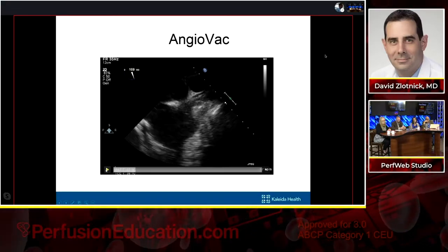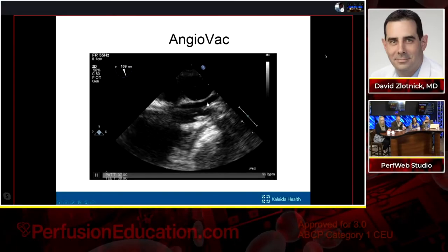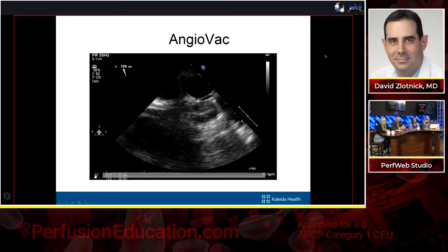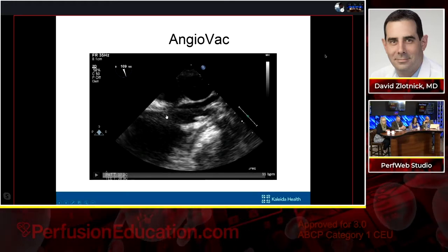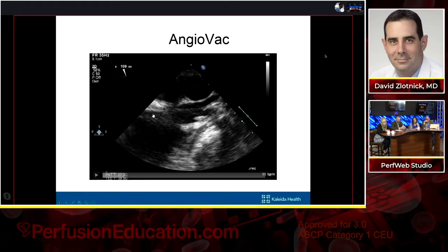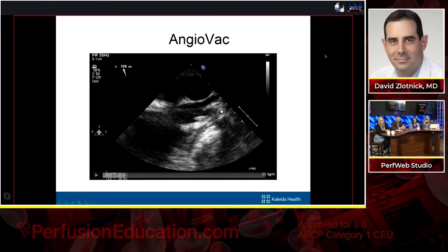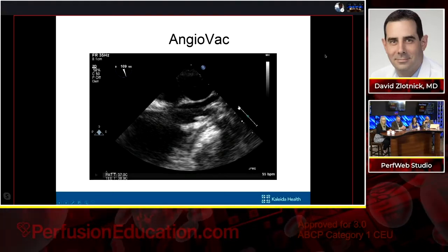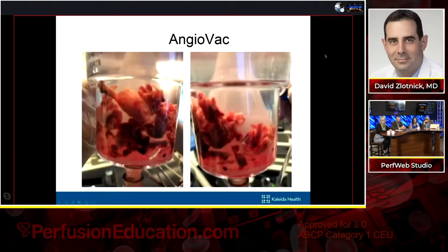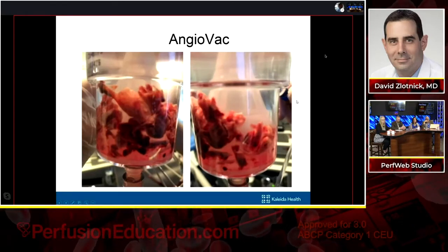What I'm showing in this video is basically the AngioVac cannula coming up through the IVC, through the right atrium, and then here's the balloon tip with the funnel, basically debulking the thrombus in the SVC. After we got done, this is what the filter looked like. We got a lot of thrombus material, and we were able to debulk.